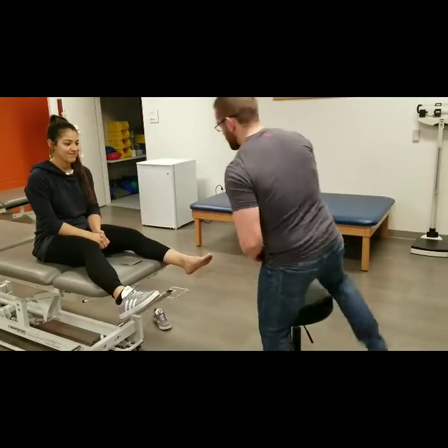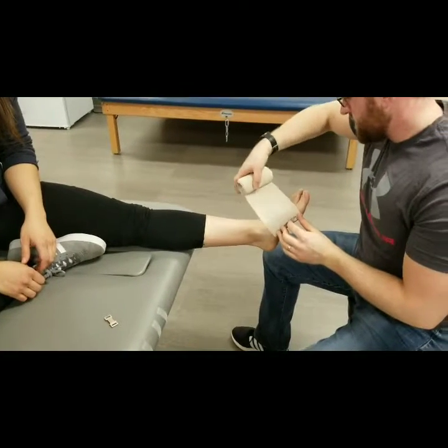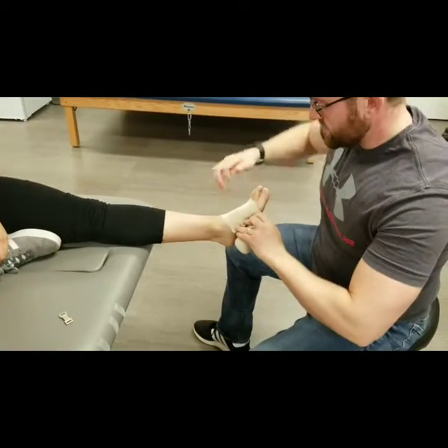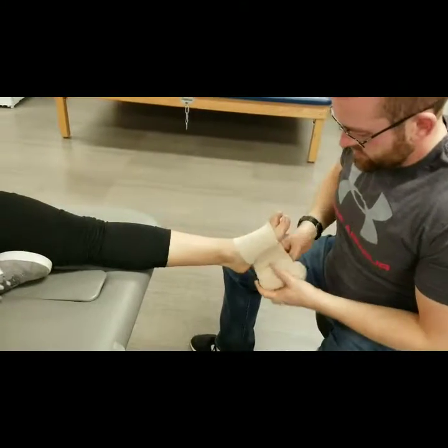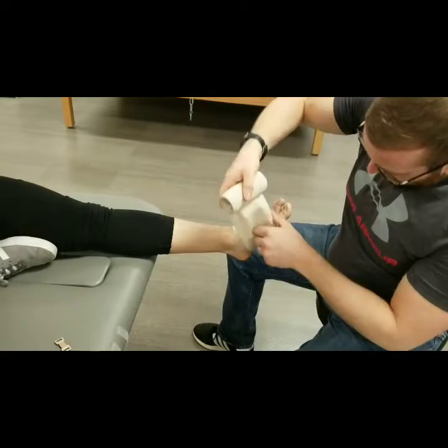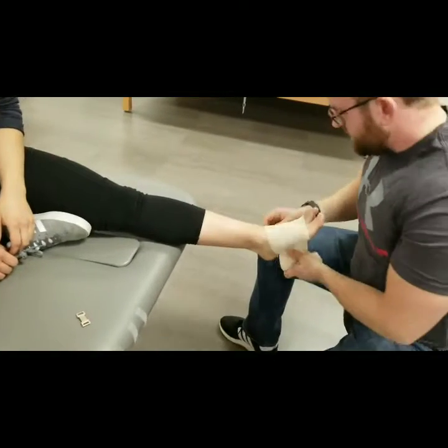All right, so now we're going to begin the wrapping. We're going to start wrapping the medial side of the foot, at the end of the metatarsals here, trying to keep as much pressure as we can towards the foot, and then lessening that as we go up the leg. Going to get a nice base here around the foot, and then avoiding any creases. We're going to start the figure 8 pattern.